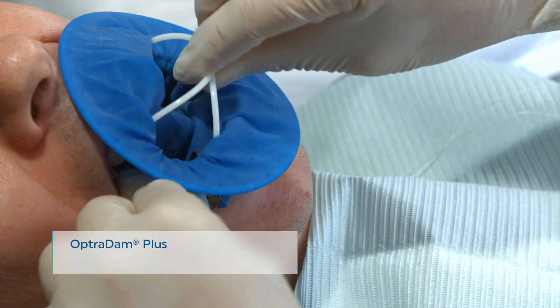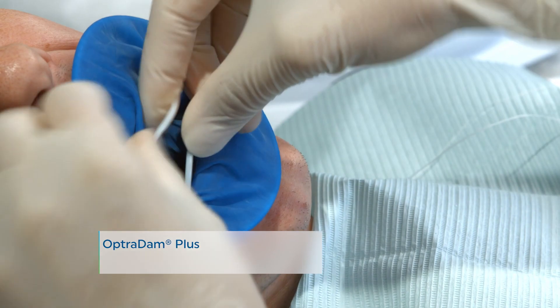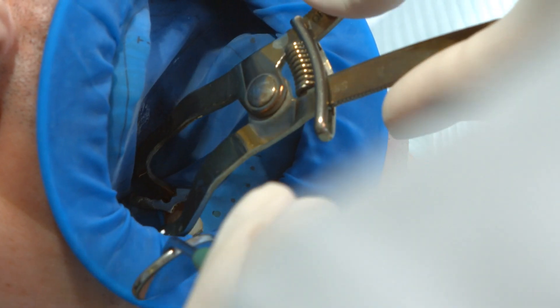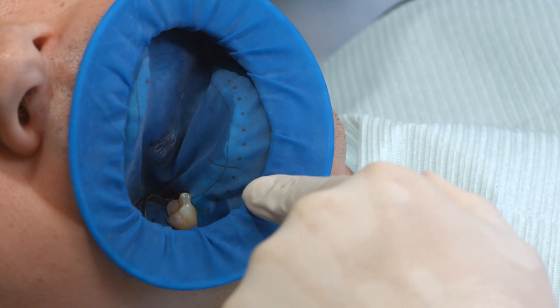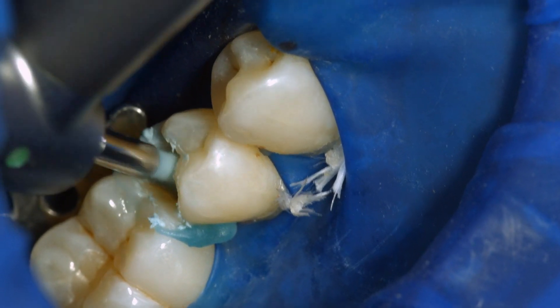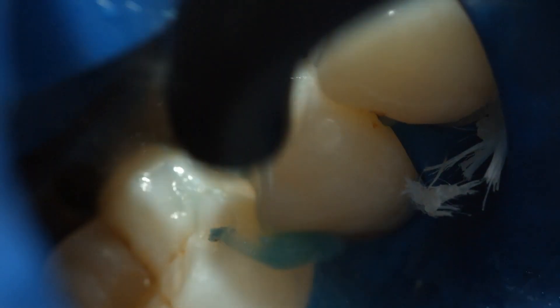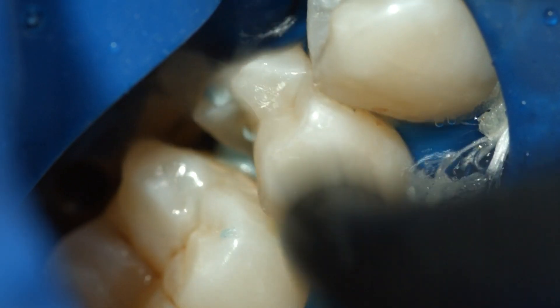When an adhesive luting protocol with composites is used, reliable isolation of the operating field is indispensable. Preferably place an anatomically shaped rubber dam, such as the Optra Dam, or alternatively use cotton rolls and a saliva ejector. Clean the preparation again with a polishing brush and a fluoride-free cleaning paste, such as a fluoride-free Proxit. Rinse the preparation with water spray and dry it with air. Avoid over-drying.